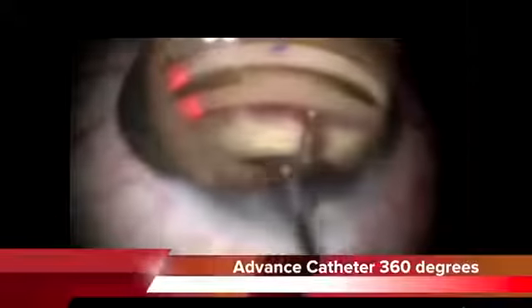360 degree fashion. Note it is important here that you keep the catheter parallel, and also note that I zoomed out here so as to allow the surgeon to observe in his peripheral vision the tip of the microcatheter as it comes around. So in addition to keeping your eye on the tip, you can also have a feeling of where you are and how much further you need to go. A smooth, continuous action of feeding the catheter in a 360 degree fashion until the tip reappears at the site of the goniotomy.